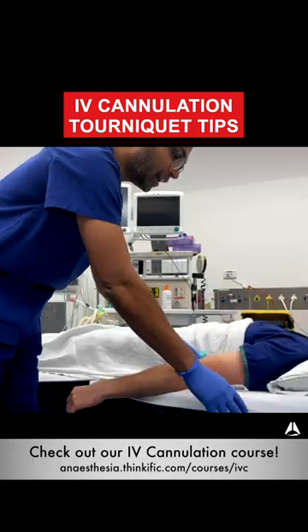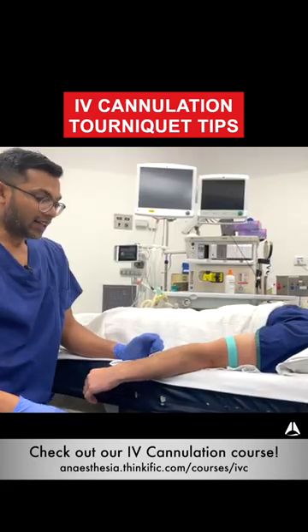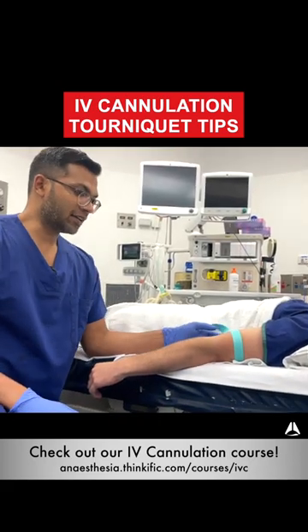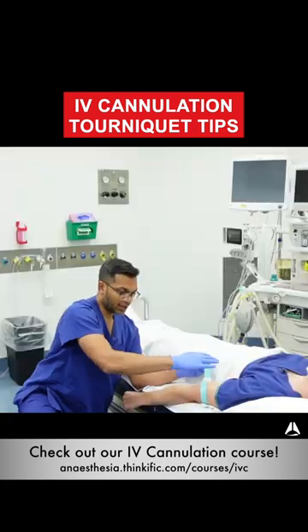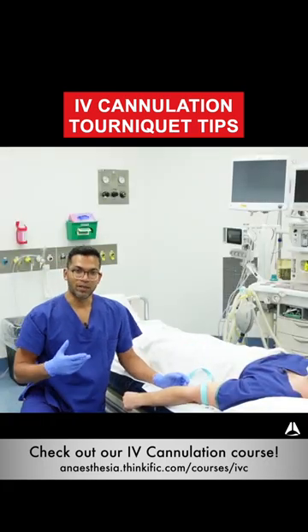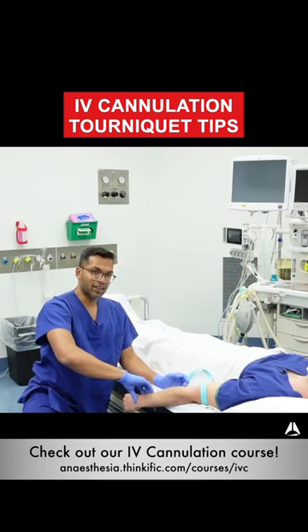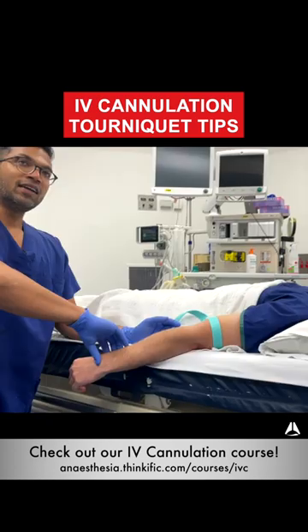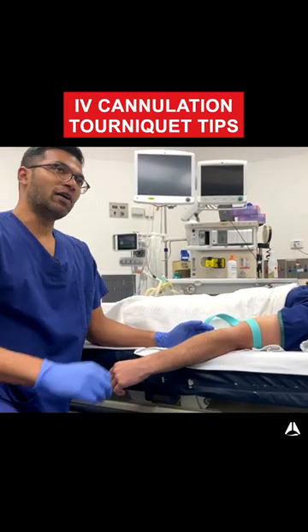The first thing I do is put on a tourniquet, and I do this even before setting up my equipment. The tightness of this tourniquet is really just a gentle pull. You know it's too tight if the patient is complaining or if you can't feel an arterial pulse. Remember, this is a venous tourniquet — you just need it above venous pressure and not above arterial pressure.